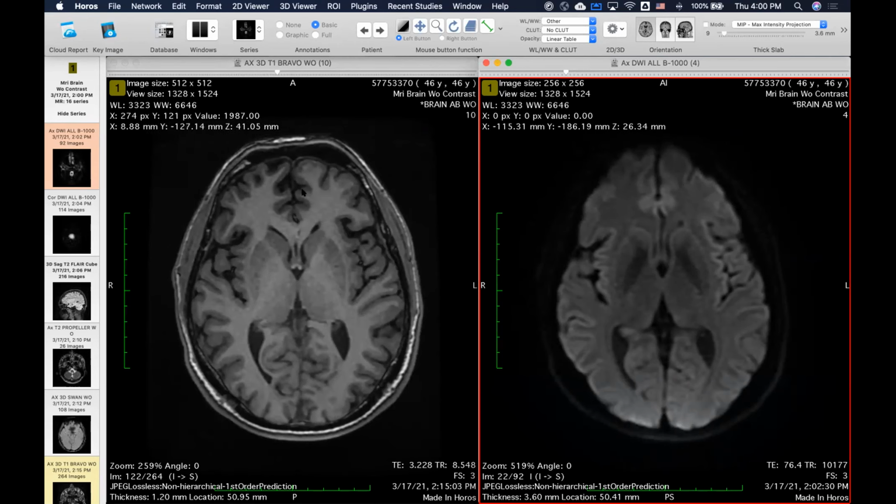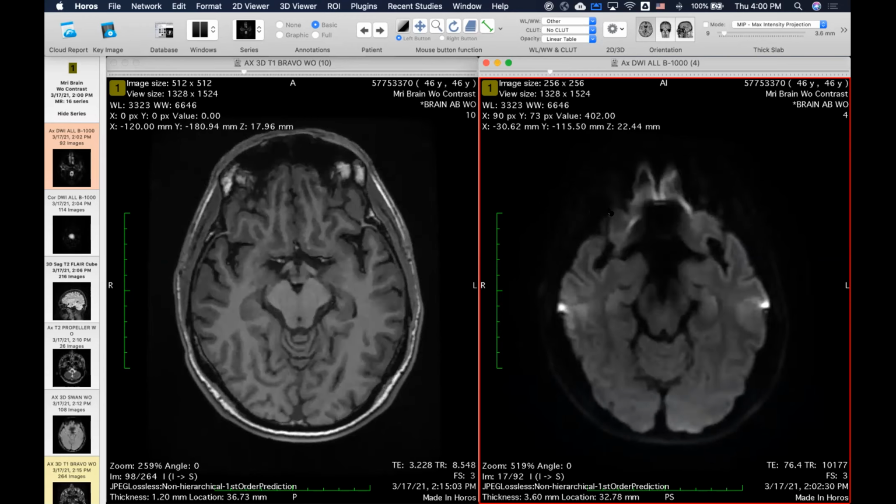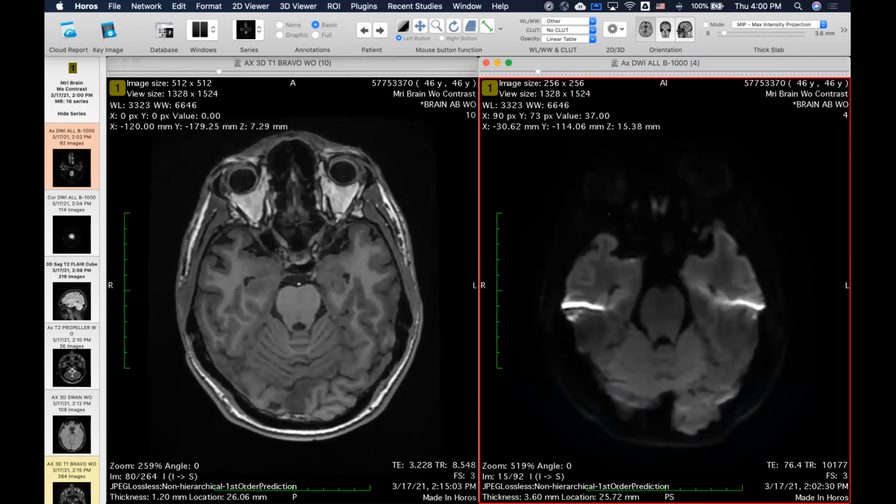Like you see the distortion? There's significant distortion going on here. Like that lobe over here, it looks so nice. You know, it kind of blobs, and you have this elongated part of the head. And that's again because of geometric distortion due to susceptibility. Now this is really bad at the bottom. Oh, what are these?